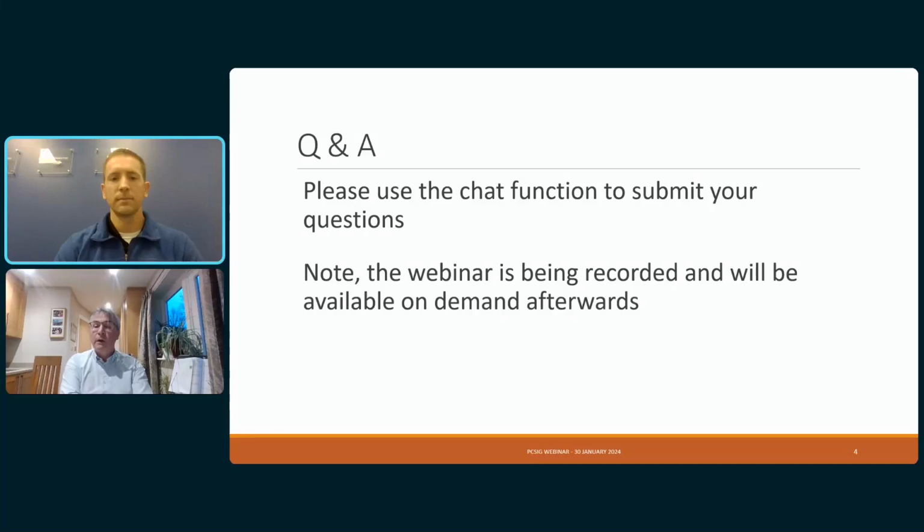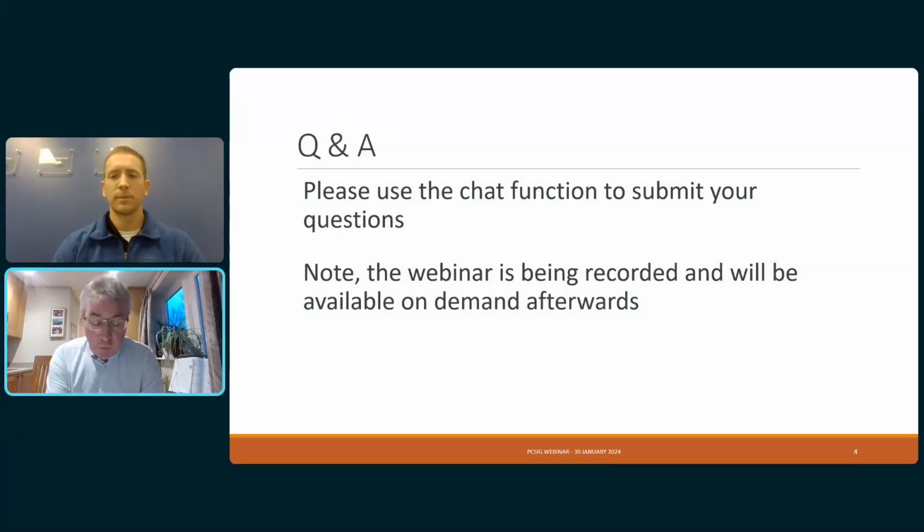Yeah, absolutely. And hematocrit is known for some molecules to affect recovery, and it can affect suppression effects as well. So it's something that definitely has to be looked at for each molecule, even though you've collected a fixed volume of blood. So the volumetric hematocrit effect has gone away. There are still other effects, and drying can affect that as well.